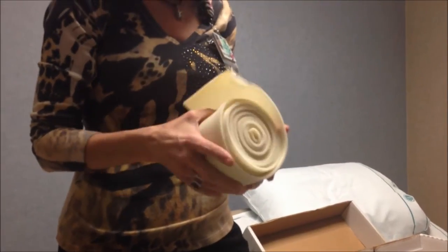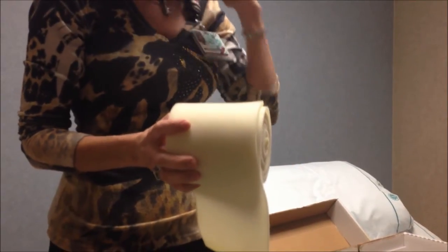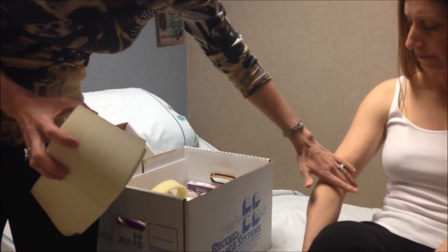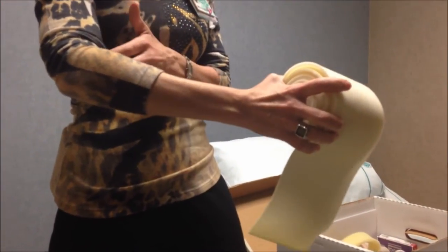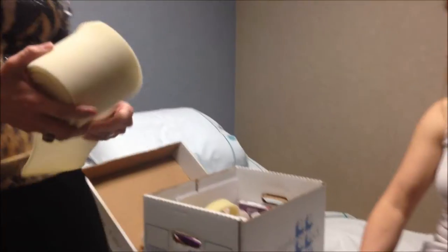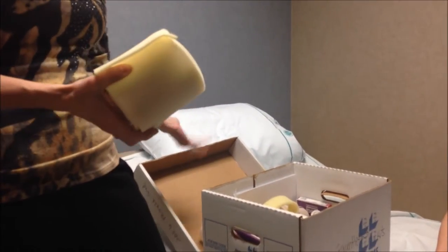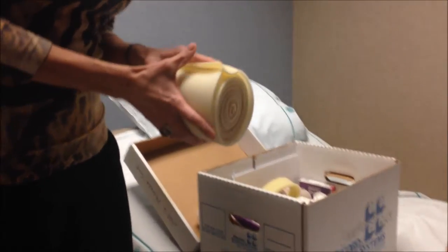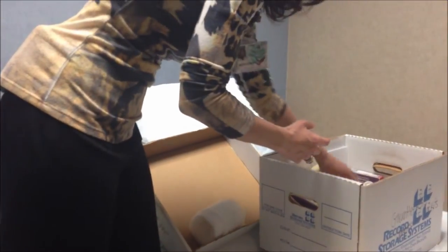I almost always wrap with foam, even on the arm. It's sometimes good because it helps to give more padding in the elbow crease, because as people are wrapped and using their arms they get irritated sometimes. Sometimes I'll even just cut a piece of foam and lay it in the middle if I'm using the cotton. Some people just can't stand the heat that comes with using the foam, so we do use the cotton — it just varies. Bandages come in all sizes and shapes, and you have to use what fits the person. A lot of times on our evaluation we determine what those needs are.